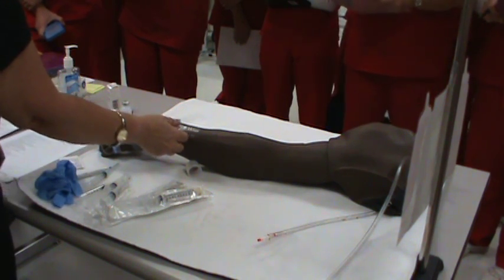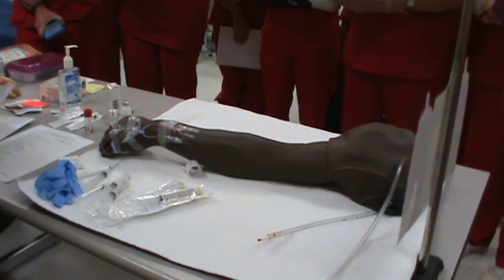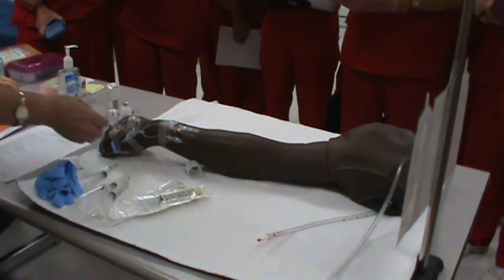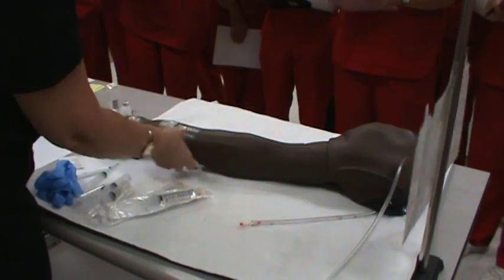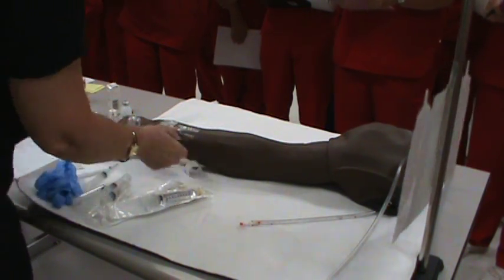Occluded in. So have an IV existing line, but anyway, your tubing would be here to be attached to here.